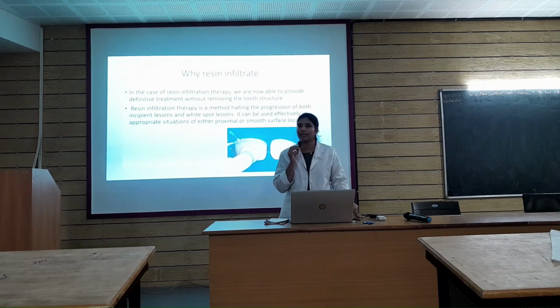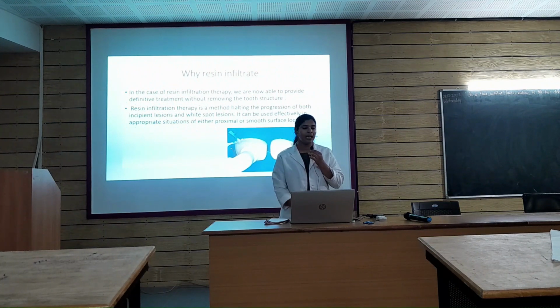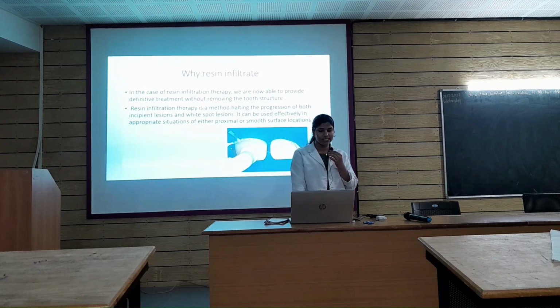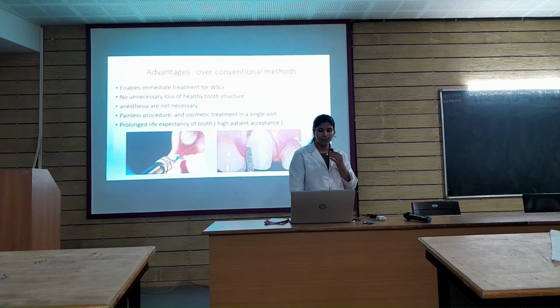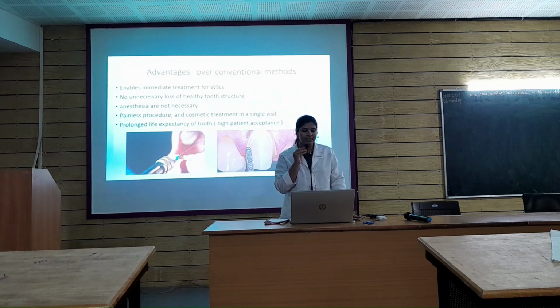In the resin infiltrate technique, the treatment is given without removing the tooth structure. The resin infiltrate technique can also treat both incipient lesions as well as white spot lesions. It can be used effectively in appropriate situations, either in proximal or smooth surface lesions. And as I spoke earlier, it has advantages over the conventional method. The foremost important point is the preservation of tooth structure. In the case of veneers, there is a loss of tooth structure, but in the case of resin infiltrate, there is no loss of tooth structure. In addition to that, it's a painless procedure.